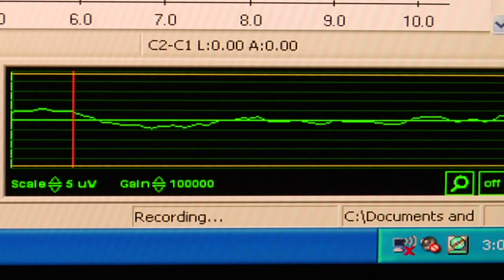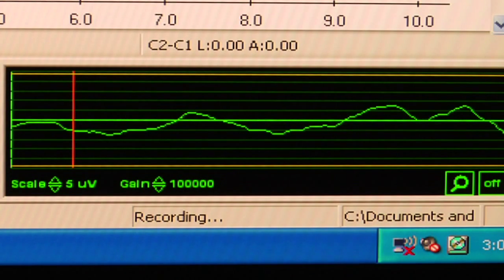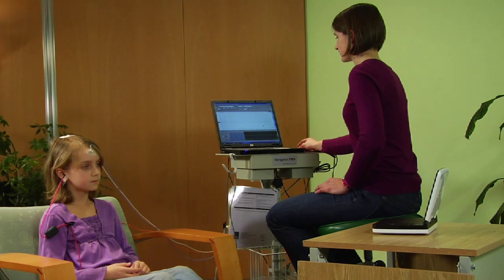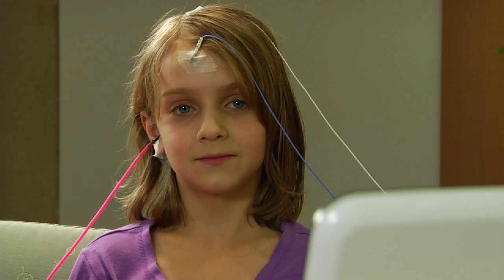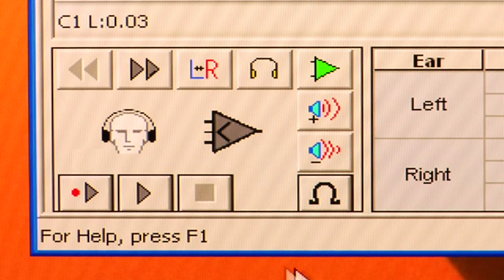Now select the Biomark protocol. Monitor the EEG to make sure that the person is calm. When everyone is ready, click the Record button.